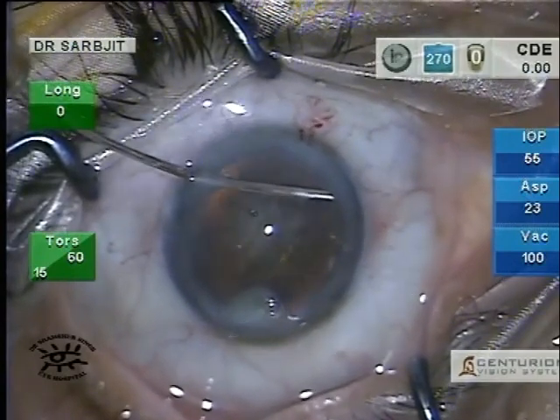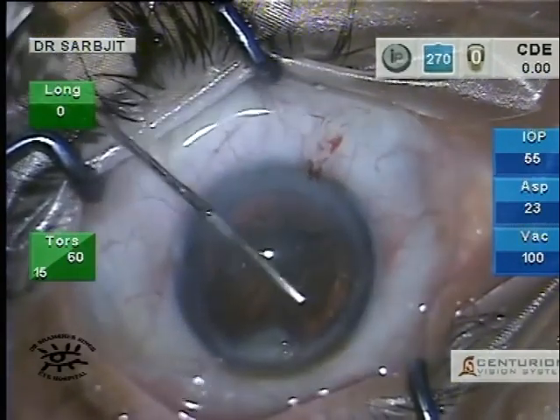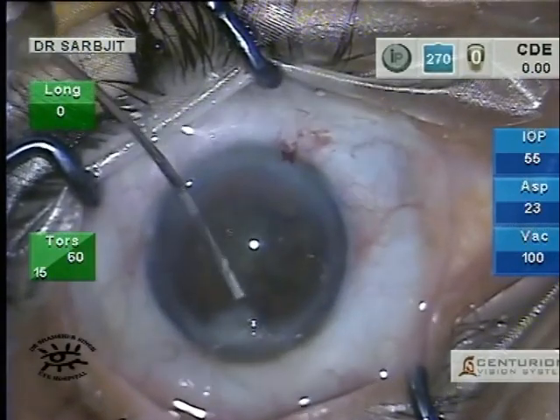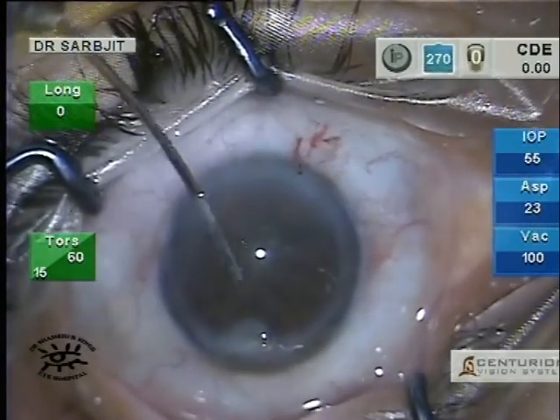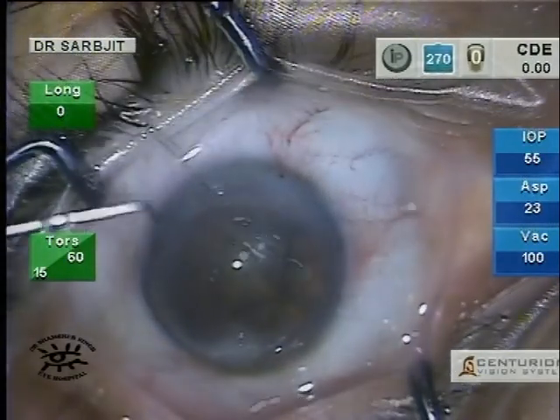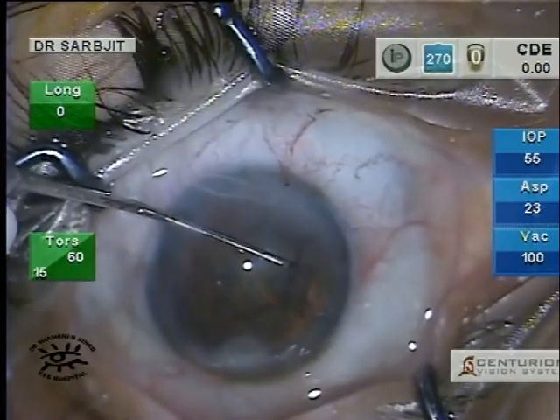You'll see a nice fluid wave going behind the nucleus. Then press over the nucleus to burp any extra fluid which might have gone into the capsular bag. The nucleus is rotated to make sure that it is free from the capsule.